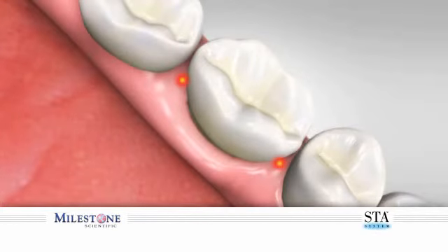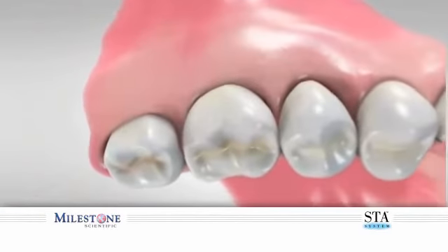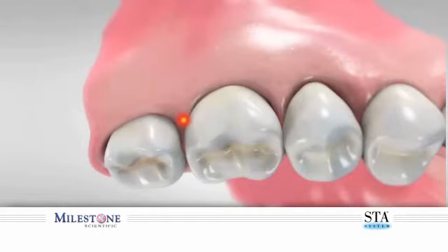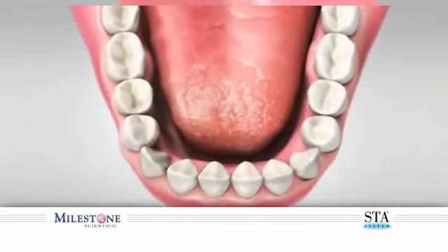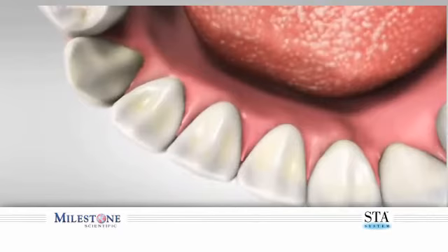The injection can be performed anywhere from the lingual line angle to the interproximal contact for each root of mandibular molars. For the maxillary molars, it is recommended that you initiate the injection from the distal buccal root, followed by the mesial buccal root. The injection can be performed anywhere from the line angle to the interproximal contact area of this tooth. When performing an STA intraligamentary injection on a single rooted tooth, it is necessary to use only a single site. You may choose to inject into multiple sites on a premolar or anterior teeth, as this is optional.